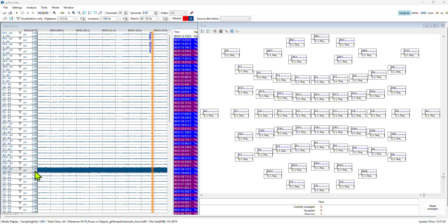You can try adding a lot of gel, or if it doesn't work, you can simply exclude it from the screen. Also in analysis, exclude it from the analysis.